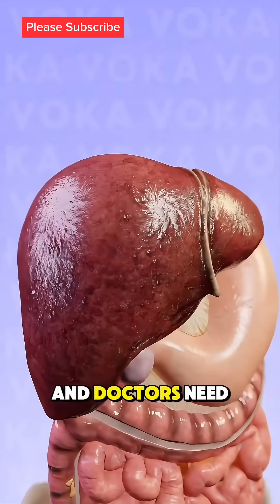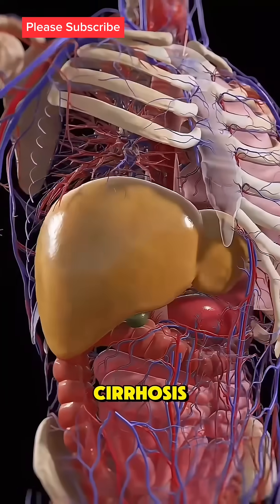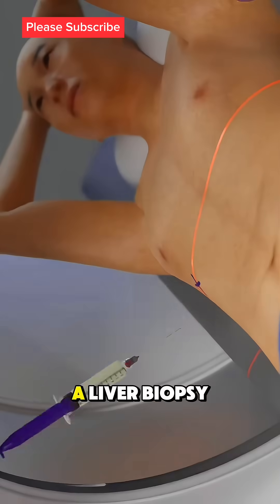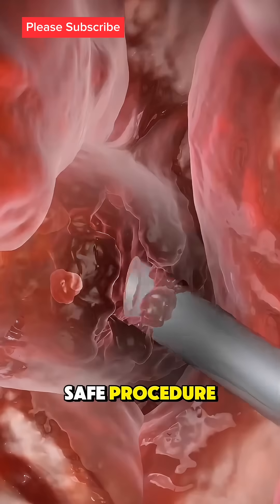If your liver is damaged and doctors need to check for diseases like hepatitis, fatty liver, or cirrhosis, they might perform a liver biopsy. But how does it work? It's a quick and safe procedure.